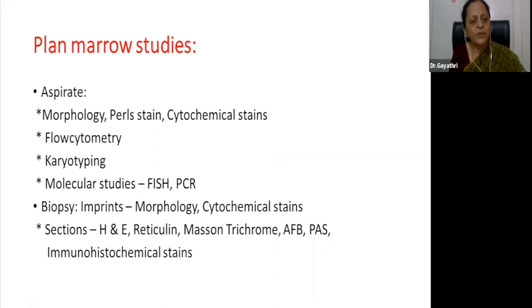Collect marrow aspirate so that you can go back and make extra smears from the EDTA sample in a cooler laboratory setting. Make sure that you have enough unstained smears to do routine Perls stain. Keep enough to do cytochemical stains. Keep enough aspirate in EDTA to be able to do flow cytometry to establish the immunophenotypic profile if that is needed. Ensure that you always collect marrow aspirate in sodium heparin to do routine karyotyping.